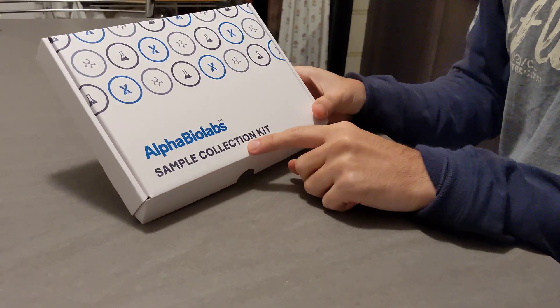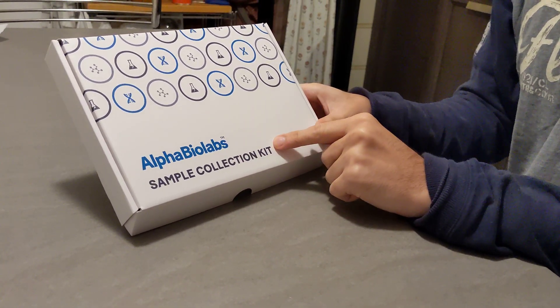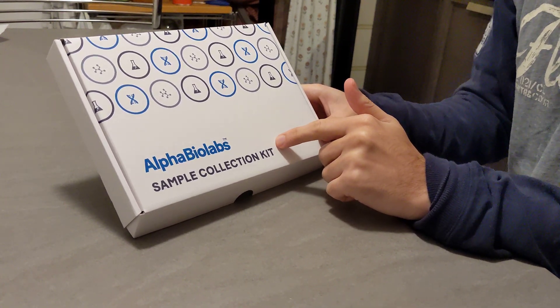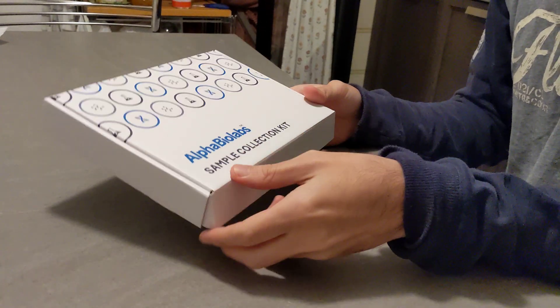I've just got the sample collection kit for COVID-19 provided by Alpha BioLabs. This kind of kit is going to be shipped across the UK and used by pretty much everybody to test for COVID-19. You can do it yourself at home and it's fairly easy.